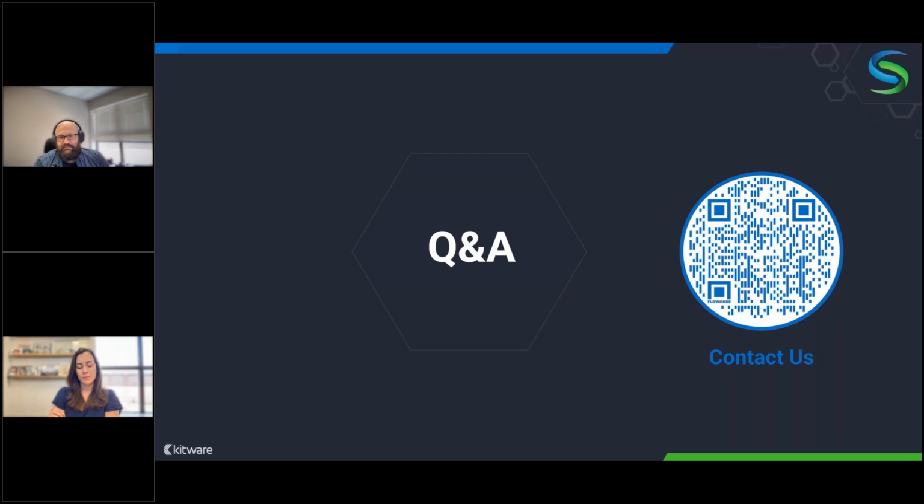Right. When we started this project, our goal was to have every single module as a Slicer extension. However, for some of them there were diminishing returns; we had very specific modules that didn't make sense to push to the extension index. But maybe you can push some of them if you want. And for the rest of the attendees, the extension index is just the plugin system in Slicer, how you install all the custom modules in the library.